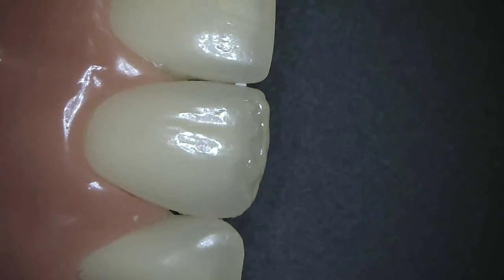And then we cure like so, for 20 seconds. Going through your adjustments in incisal guidance, be certain that you have a balanced movement and this will hold up quite well.